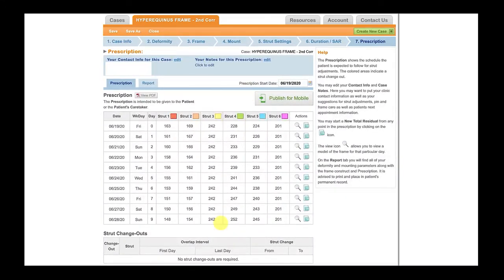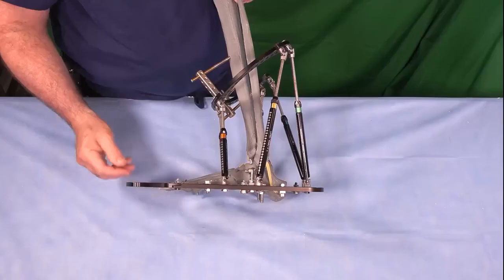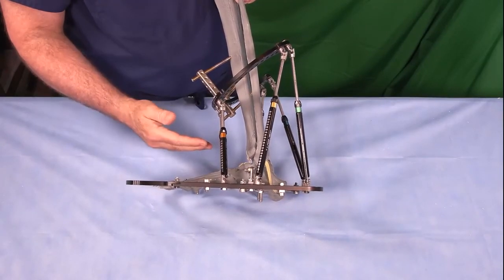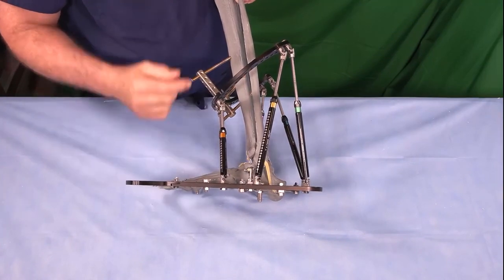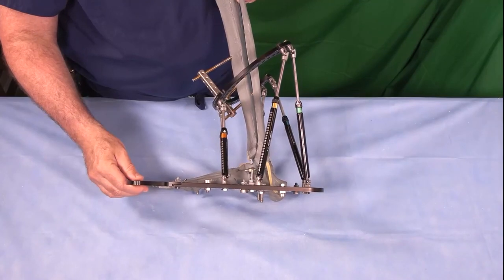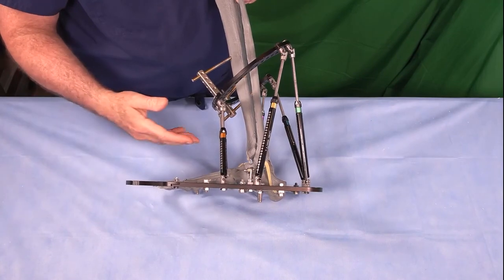Note, however, that there's no strut changes, so we don't have to go through that. We use the same struts, and let's go back upstairs to the lab and see what our final frame is going to look like after we do this additional 15 degrees of dorsiflexion above neutral. I've just completed the residual program in order to gain additional dorsiflexion beyond neutral. And so now if you look at the angle between the tibia and the plantar surface of the foot, we're at about 15 degrees of dorsiflexion. So that's the end of the program.